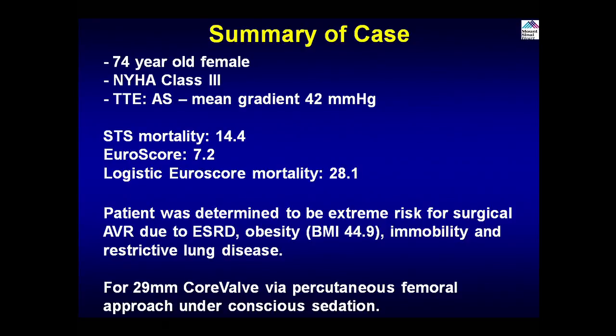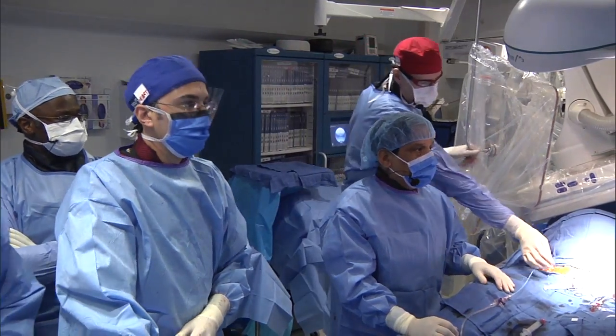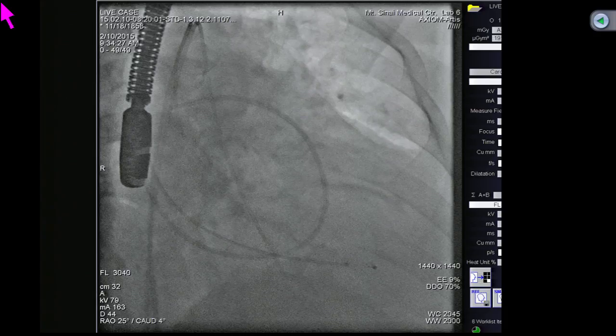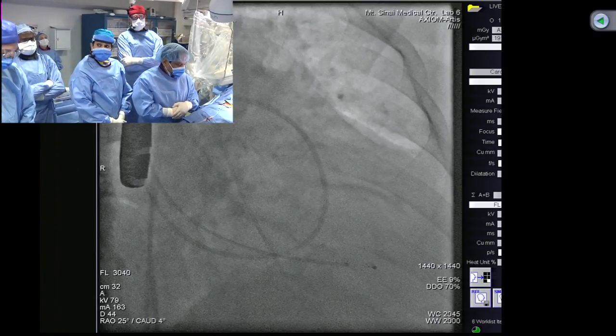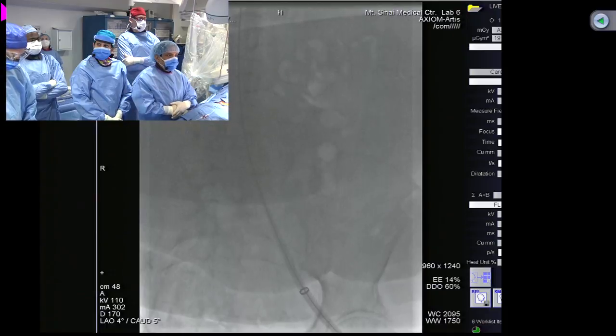Okay, so that we are all set and ready. If we show the aortogram, now the question is that we did not see that unicuspid even on the CT. Now maybe just because of the patient's body habitus, as JK showed, very fuzzy aortic valve appearance.